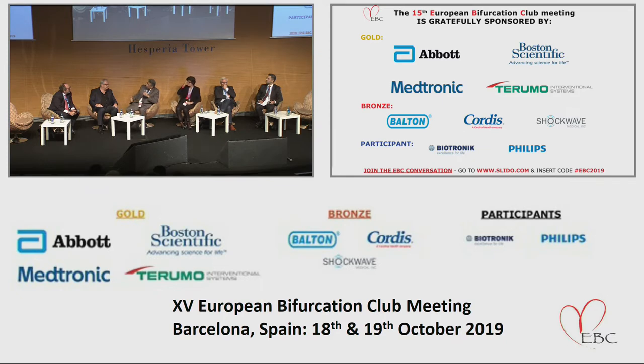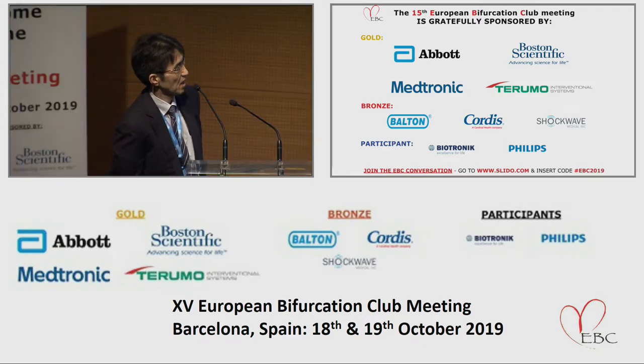According to you, what is the minimum number of OCT runs that you would recommend? After wire crossing, first? First for plaque characterization, second after wire crossing, and third final, three? Three, yes. Pre-procedure, after wire recrossing, and final assessment.